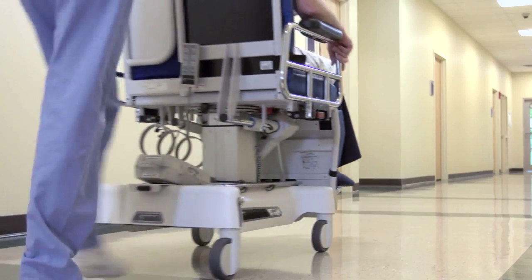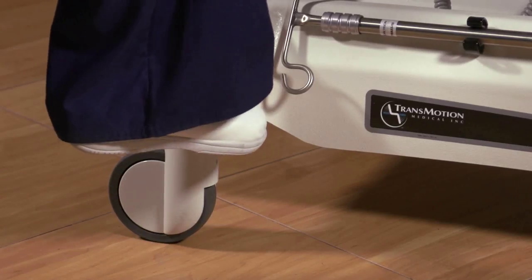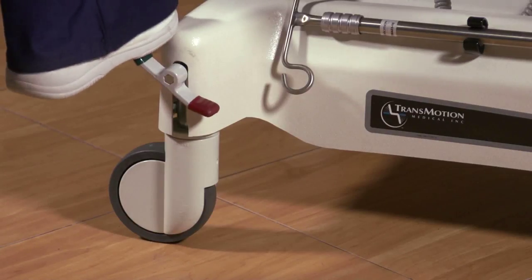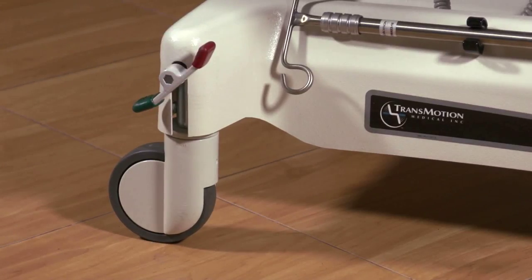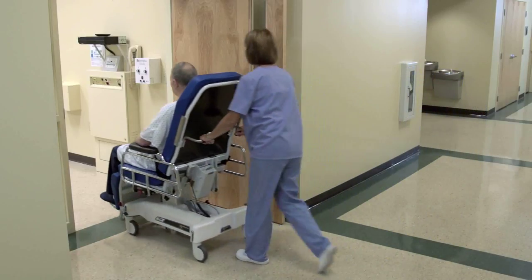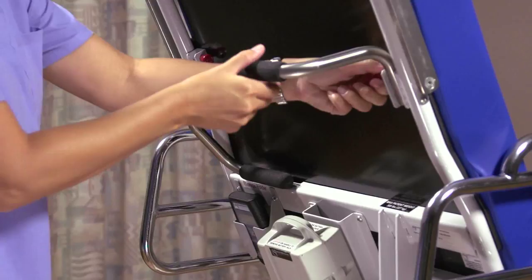The four-wheel brake and caster system makes steering and stopping easy. Remember, red means stop and green means go. When you push the red brake lever down, you lock all of the casters. When the brake is in the level position, all four wheels rotate freely. And when you push the green lever down, you lock the right front caster only, letting the other wheels trail for optimum control while you transport the patient. The chair's push bar makes transport effortless and can be released and lowered out of the way during procedures.